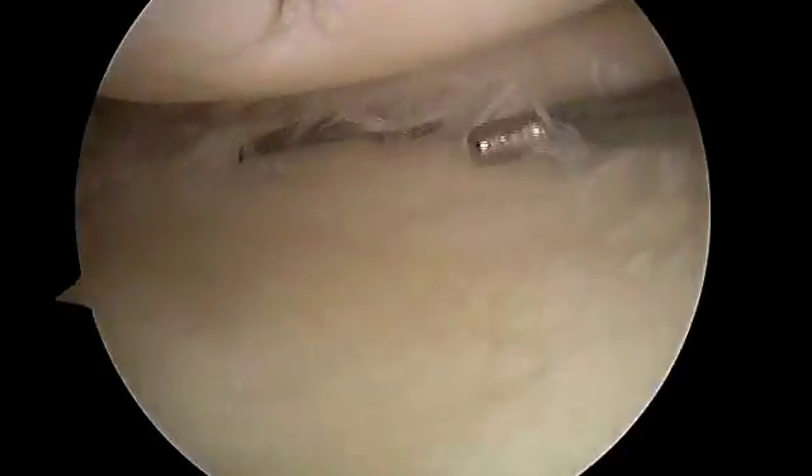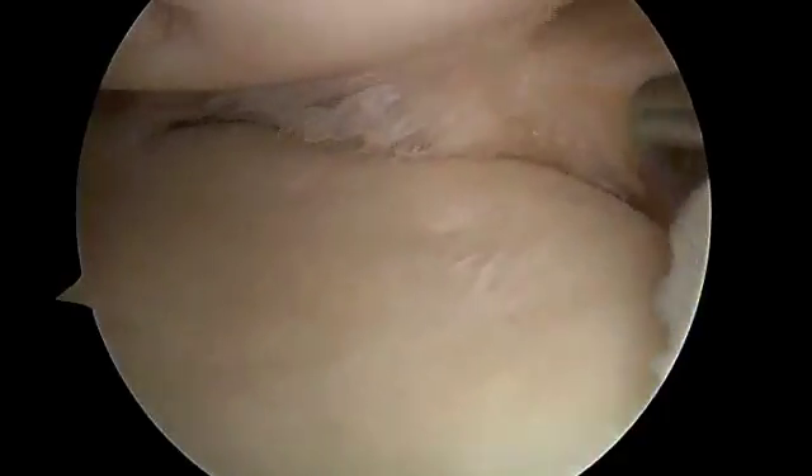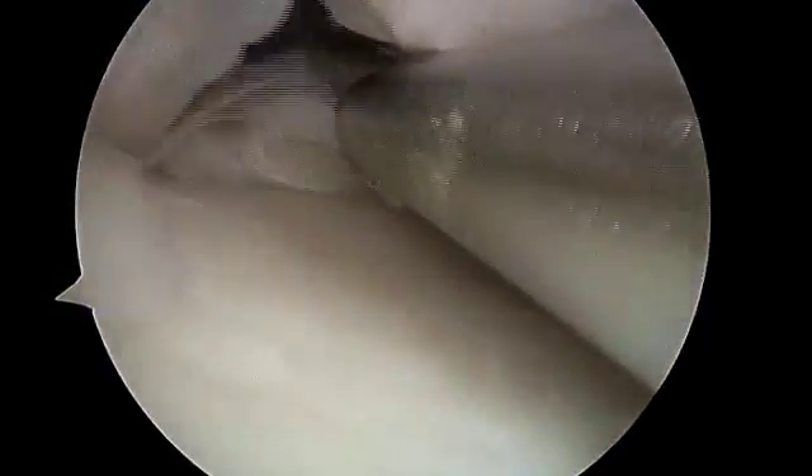This is the medial femoral condyle, and here's the meniscus. You can see the torn fibers of the meniscus here at the very back of the knee, more towards the front here. Some of the tissue has flipped up underneath itself, creating pain and also causing the persistent effusion.